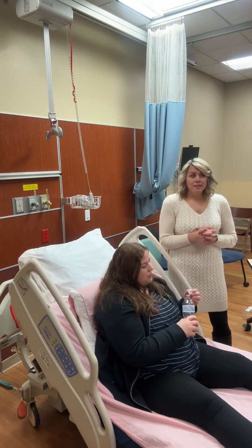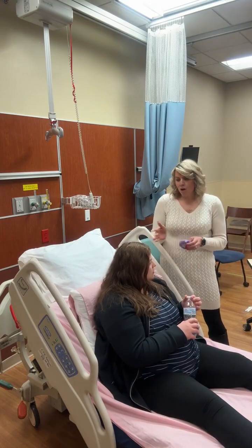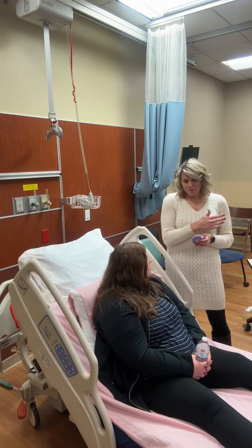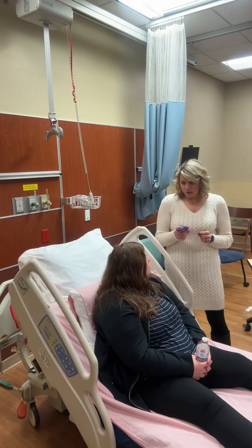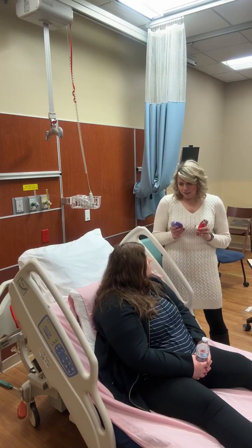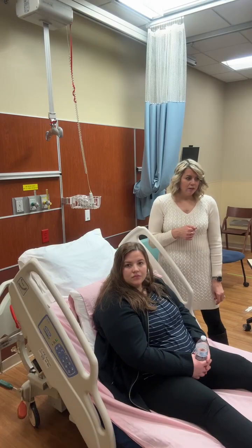and you'll see some patients who are used to doing this medication. It is a maintenance medication. It is not going to fix your problem right now. This is not like your Albuterol inhaler. This is long acting. So this is something that you're going to take every day, morning and night typically, and it works over time, okay? So I never want you to take this if you're having an acute asthma attack or acute attack. You need to use your Albuterol for that. This is maintenance, okay? So make sure you tell your patient that, so that they're not using the wrong inhaler when they're in a moment of distress.